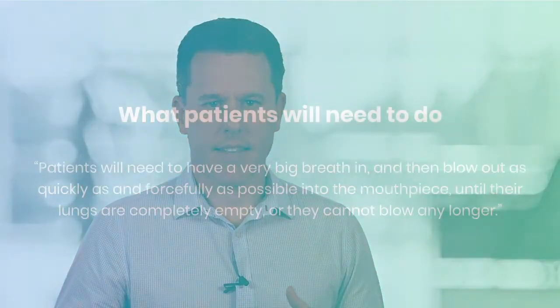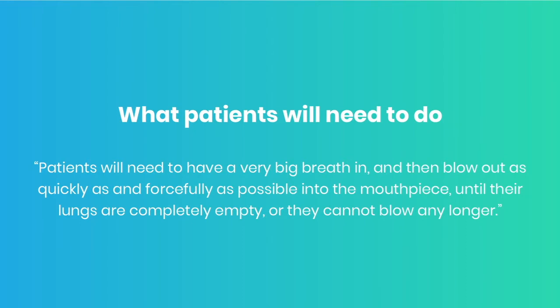So when you're doing a spirometry test, essentially what is happening is that the patient will breathe in until total lung capacity. So get as much air into their chest as possible, and from there forcefully exhale as hard and as fast as possible, and continue exhaling until they cannot get any more air out of their chest.